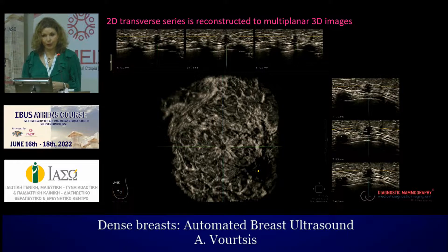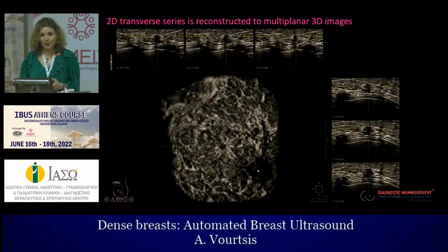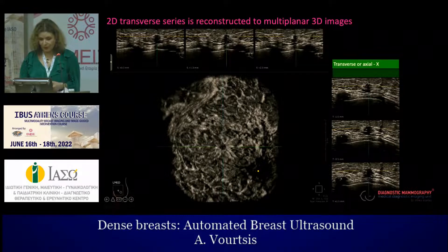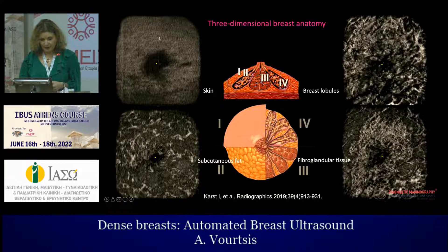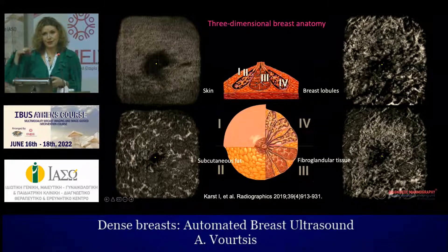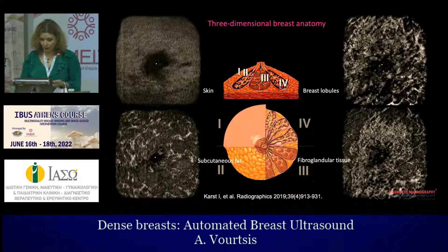A special software converts the 2D image into 3D reconstructed multiplanar images. We have a coronal image with a large field of view of 15 cm wide — almost three times larger than handheld breast ultrasound — as well as transverse and sagittal images. We can see the 3D breast anatomy from the skin, subcutaneous fat, fibroglandular tissue, and breast lobules, scanning from the skin posteriorly to the thoracic wall.